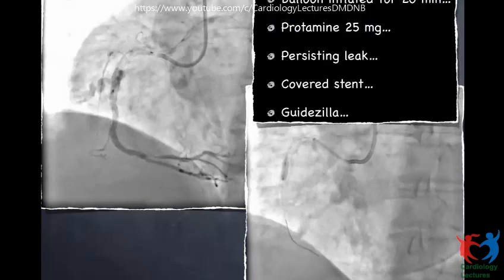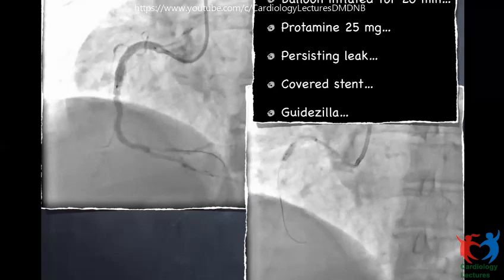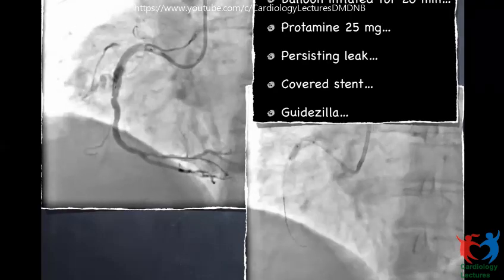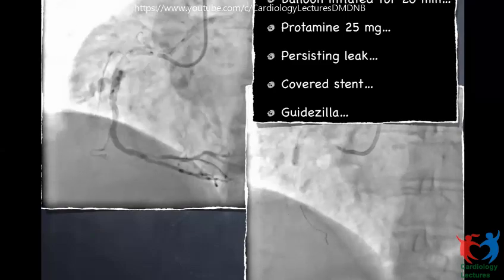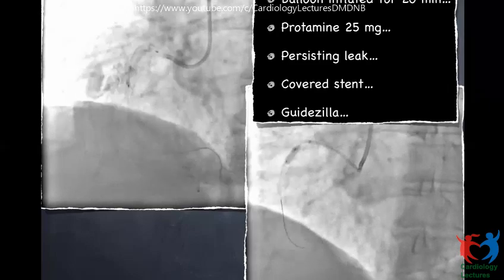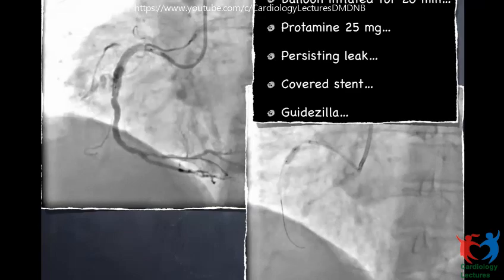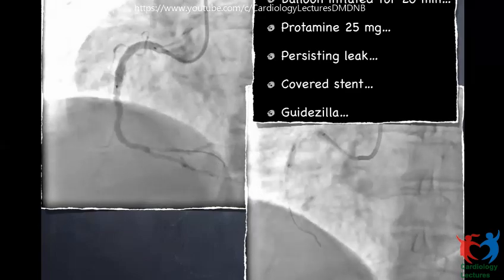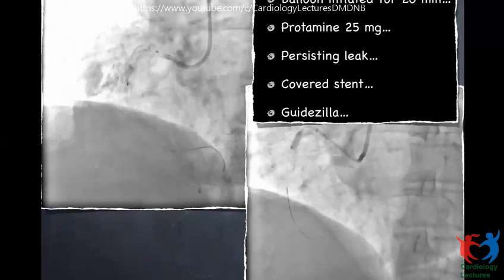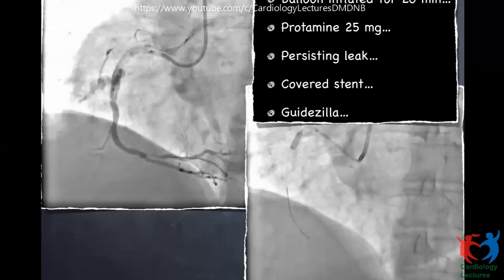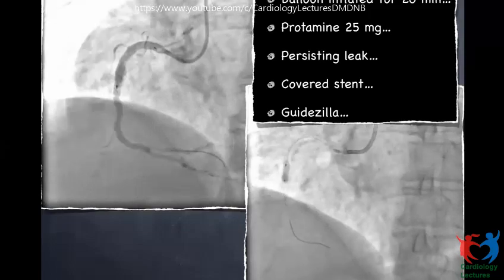After deploying the stent, we could see a perforation — not free-flowing into the pericardium, but with contrast seeping into the pericardium (Type 2). We had a little time to think. We immediately dilated the balloon and waited 15 to 20 minutes, but things were not improving. We gave 25 mg of protamine to partly reverse heparin effect. The leak was persisting, so we thought about a covered stent.